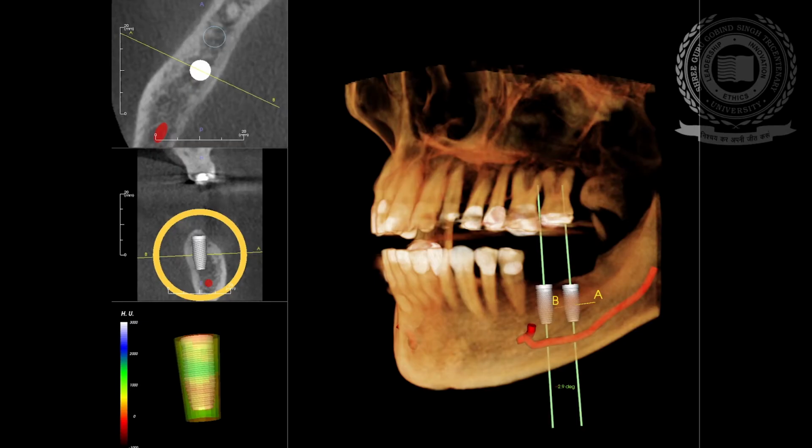Coming to the applications of CBCT, CBCT is useful in pre-surgical assessment and planning of surgical dental implant sites. It has brought down implant failures by rendering accurate information about vital structures, height and width of the planned implant site, bone density and profile of the alveolus while delivering low radiation exposure.